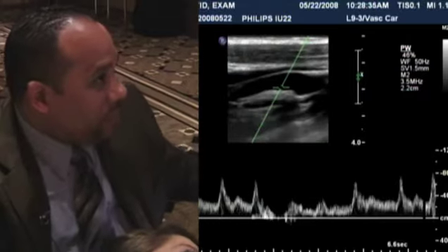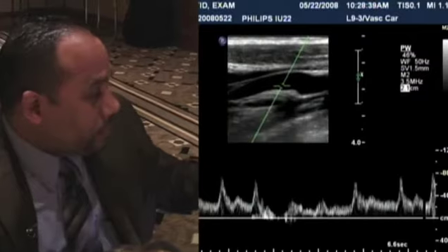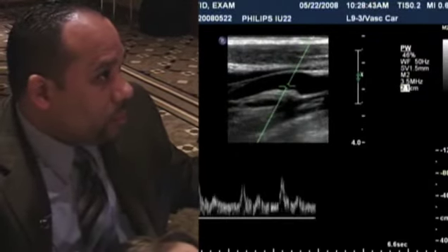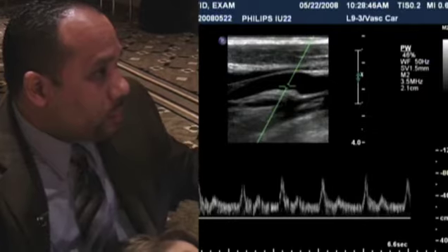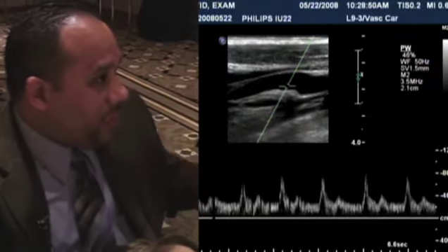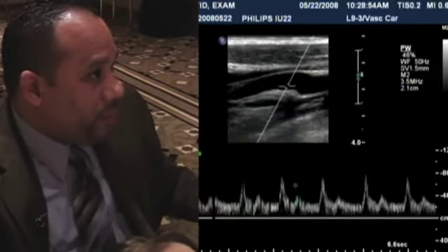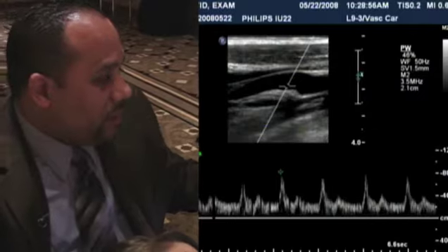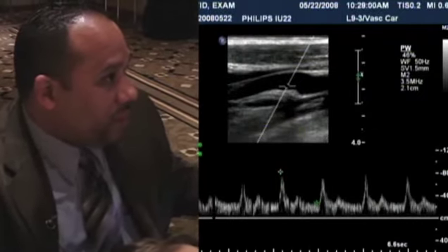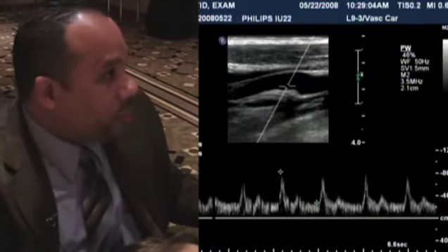And what happened there was my patient just swallowed, and that's okay, not a big deal. Just update the image. Get a couple of representative waveforms, freeze, and then again, acquire your velocity measurements, peak systolic velocity, and then the end diastolic flow velocity. And here the velocities are 82 for a peak and diastolic velocity of 27, well within normal limits.